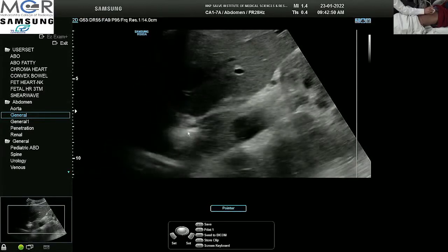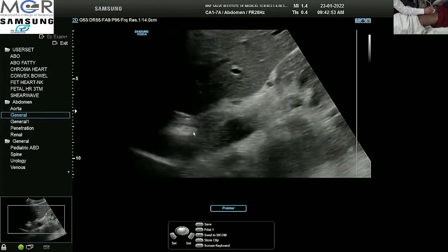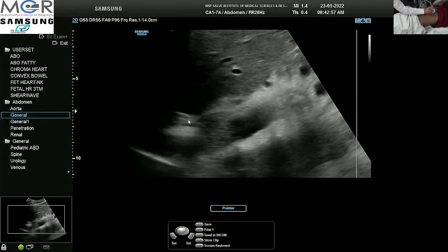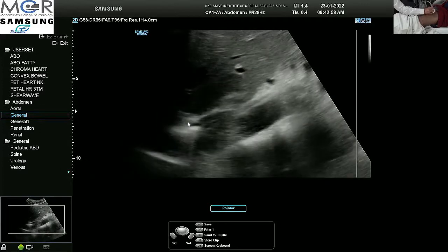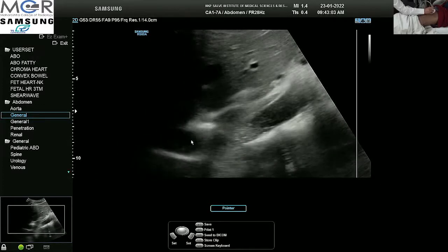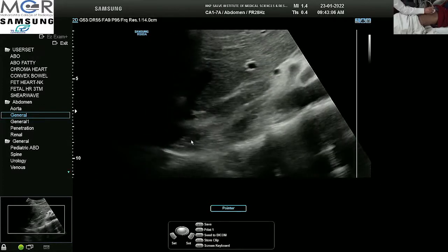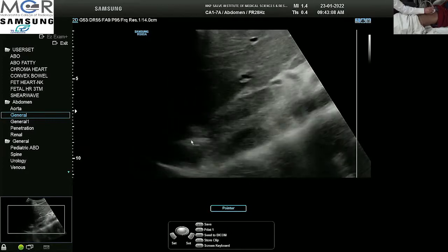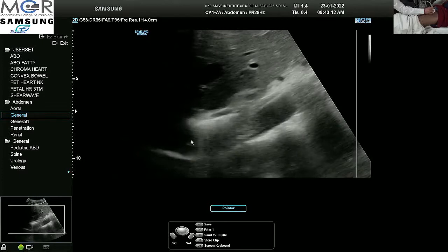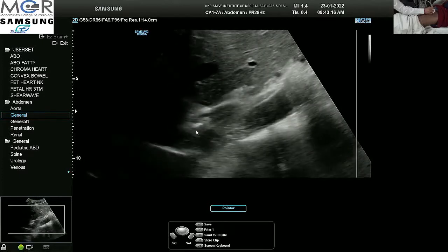This gas that you are seeing here is in the gastroesophageal junction. As you can see, it is at the posterior superior margin of the liver, just behind it, and is seen anterior to the aorta. I have asked him to swallow just to be able to see the lumen — as you can see, there is some movement of the saliva at the gastroesophageal junction.